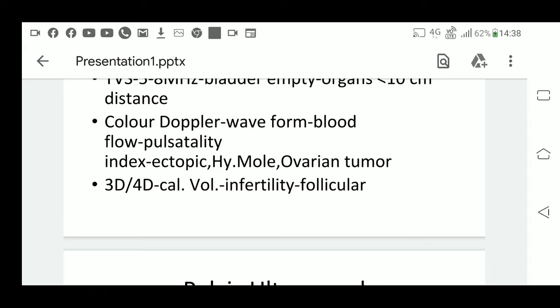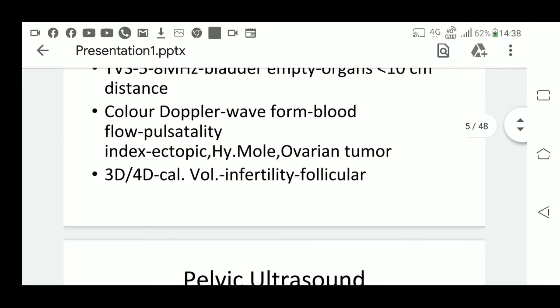Another case is ovarian tumor. Whenever we assess an ovarian tumor, Doppler may be used to find out the vascularization. If there is irregular vascularization, that may indicate it could be a malignant tumor.